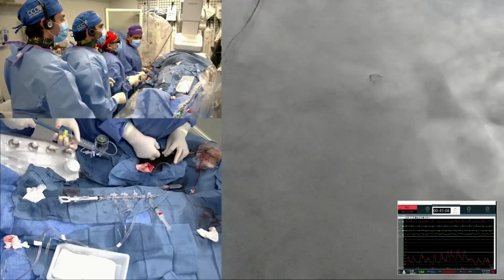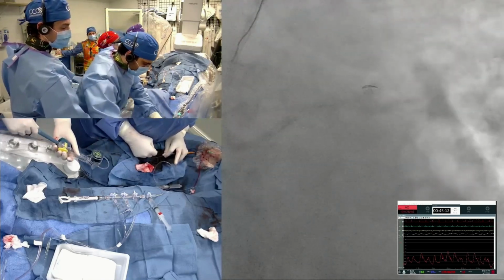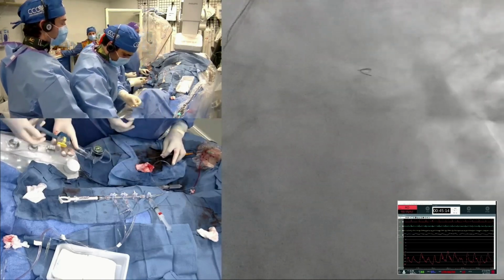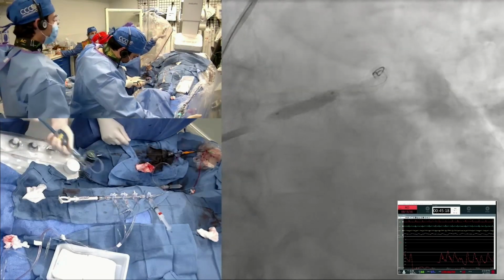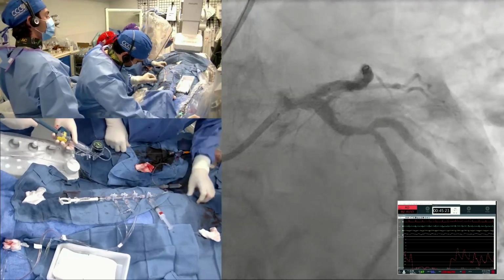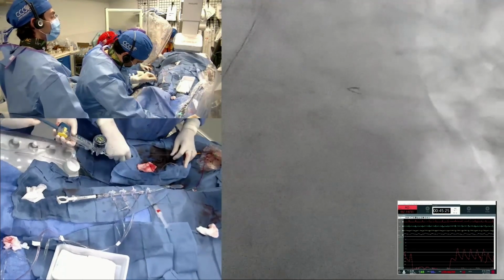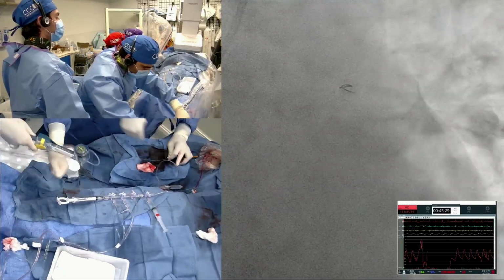All right. So what size stent did you put and how are you going to do the POT? I'm just going to tell you in one second. So basically what we have done now is a 4.0 by 16 Megatron in the LAD, and a 4.0 by 8 in the circumflex with a mini crush technique. Let's take a picture, do the IVUS, and then recross.